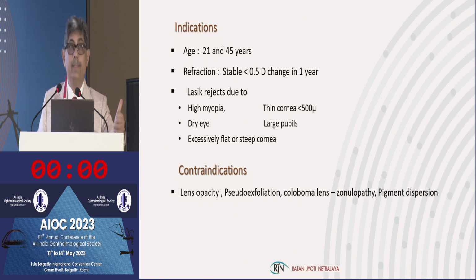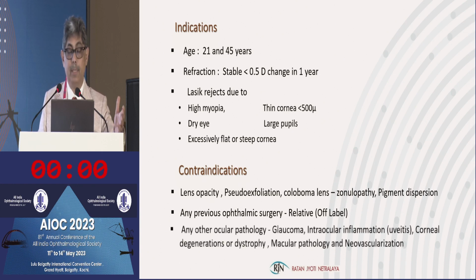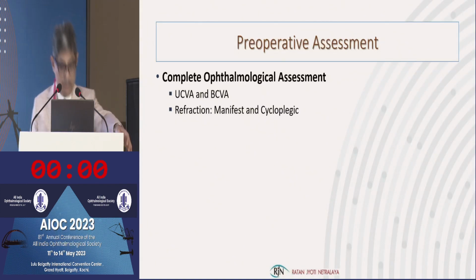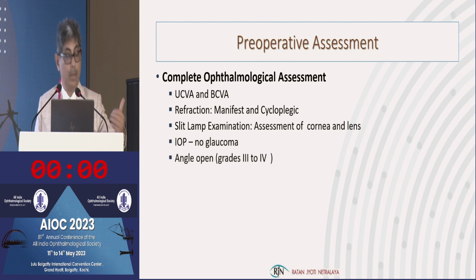The contraindications are the presence of lens opacity, pseudo-exfoliation, coloboma lens, zonulopathy, pigment dispersion, or any previous ophthalmic surgery, which is relative, and any other ocular pathology like glaucoma, intraocular inflammation, corneal degeneration or dystrophy, macular pathology like CNVM or macular edema.